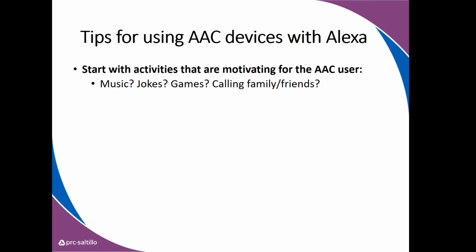If you have multiple Alexa devices in your house too, you can drop in. I use my Alexa as a little bit of an intercom, and I drop in on the kitchen, the bedroom, or the office to check on the kids too. Your AAC user could reach out to you and say, hey, mom or dad, I need help, or something's broken, or I want to tell you a joke, and they can drop in and you can speak through that Alexa like an intercom. And that's a native skill that's built in.